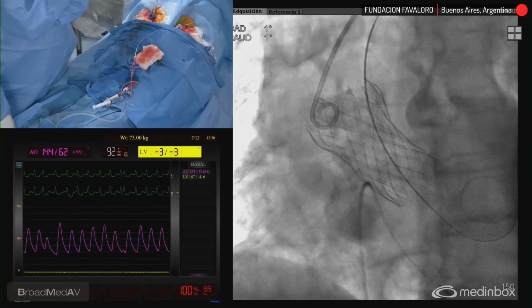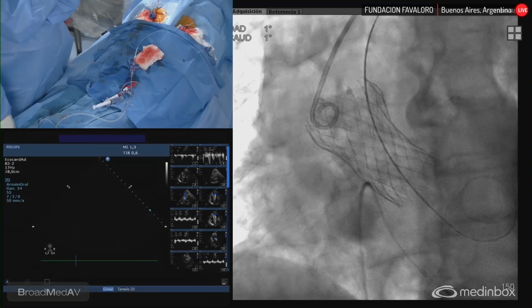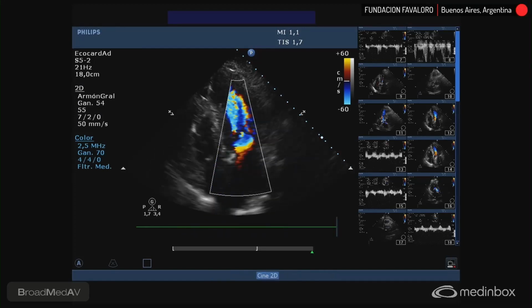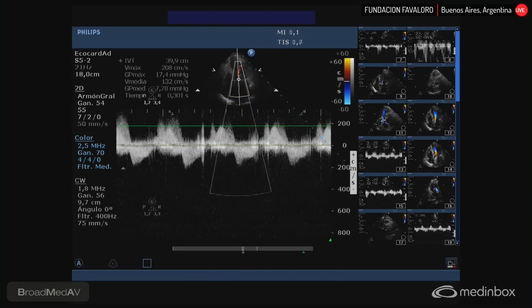Where do you find this leak? I'll show you, Dr. Mendes. The echo is not showing. Okay. Oh, yes, now. It's near the septum, the interventricular septum, right? Perfect. But it's mild. Could you show the gradients again? It was my fault. I didn't ask Philippe to show the echo. This is the aortic valvular gradient.